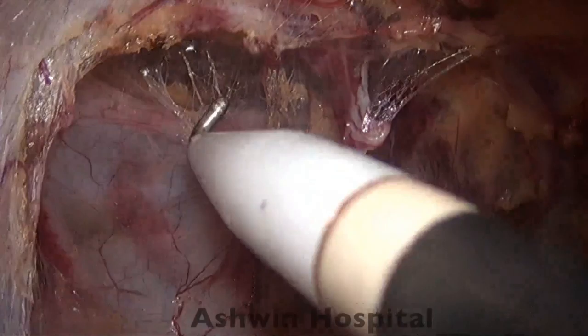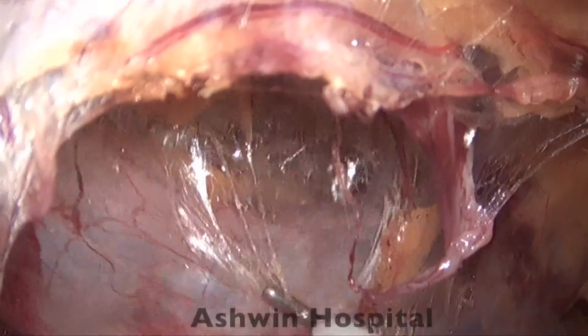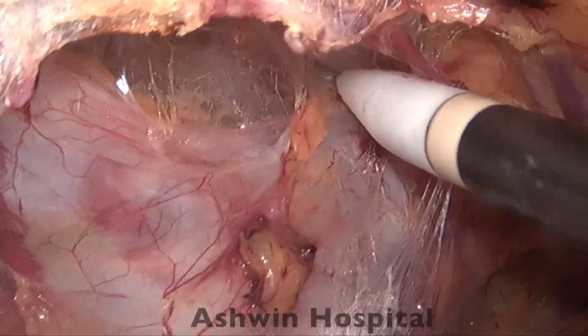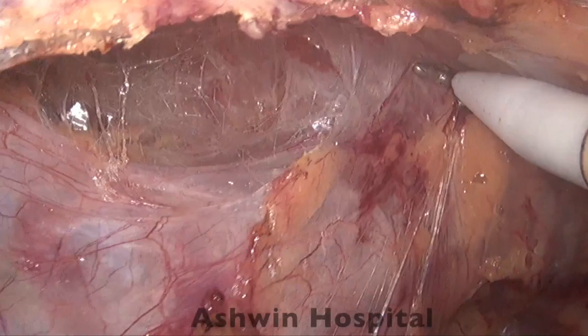So the key in TEP is always to make sure that we open up and develop all the planes which are freely available, so that once we come towards the sac dissection, even if there is a small buttonhole in the peritoneum, we won't lose the plane, a big deal. And if at all there is a buttonhole, the options to overcome that: once you have dissected well, if it's only a very small buttonhole, you can just give a good head low for the patient, and most of the times that would be good enough.